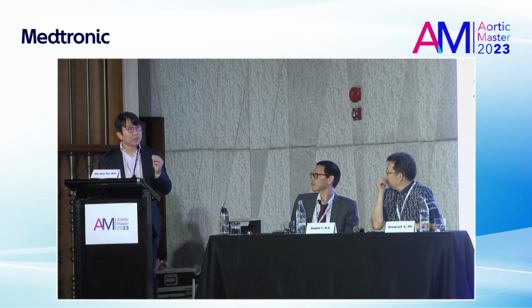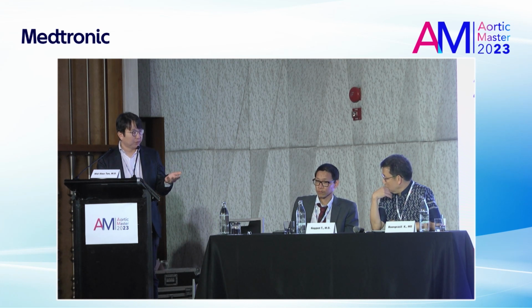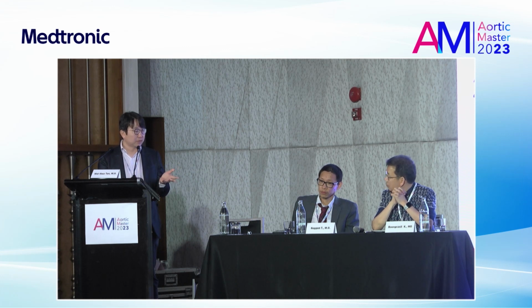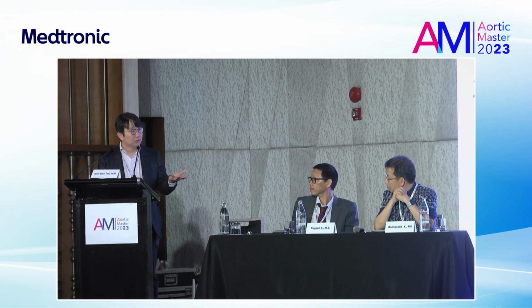If we do the case early for these cases, actually it's not difficult to find the tear. I think the only problem, where you can't find the tear or the tear is not big enough, is in the chronic cases. For those kind of cases, sometimes you might need to sacrifice some vessel. In my experience, sometimes we need to sacrifice the celiac trunk in order to get better, early false lumen thrombosis. But it's okay because you can check the SMA flow to see whether there's collateral to the celiac trunk area. So it's quite safe, I think, in my practice.